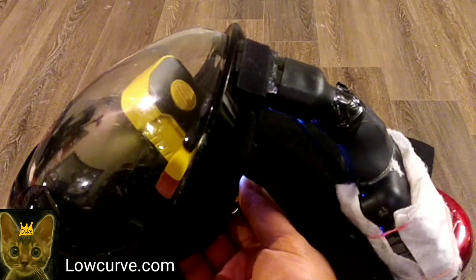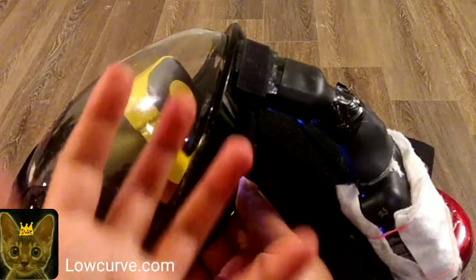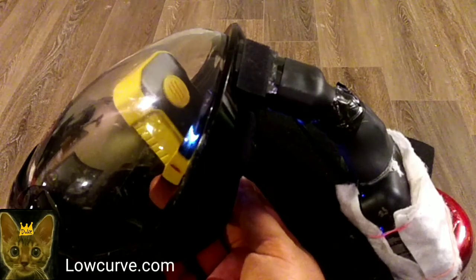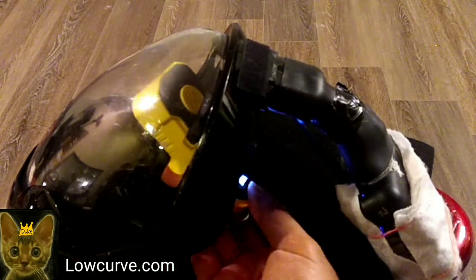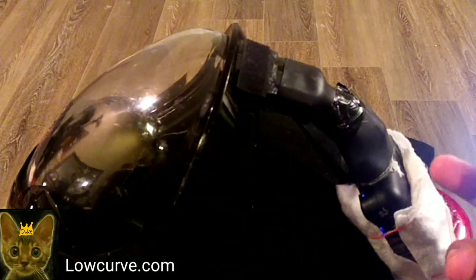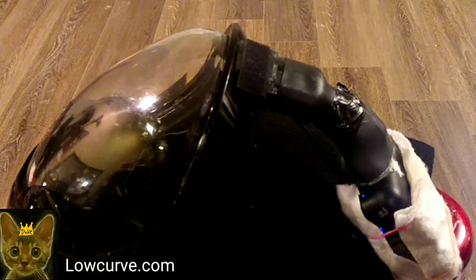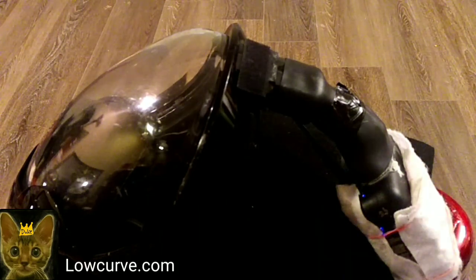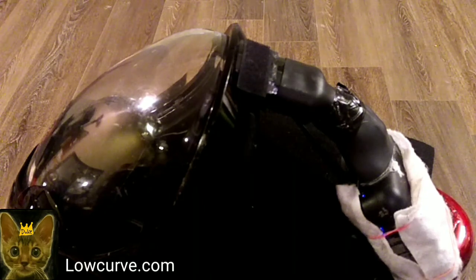So the experience of wearing this is actually pretty nice, because it's got a nice breeze coming down your face, and breathing is almost zero. There's almost zero fatigue and resistance on your breathing. And that's it. So what else? There's nothing much else I can go over on this. This is Infinite N95 version 4.